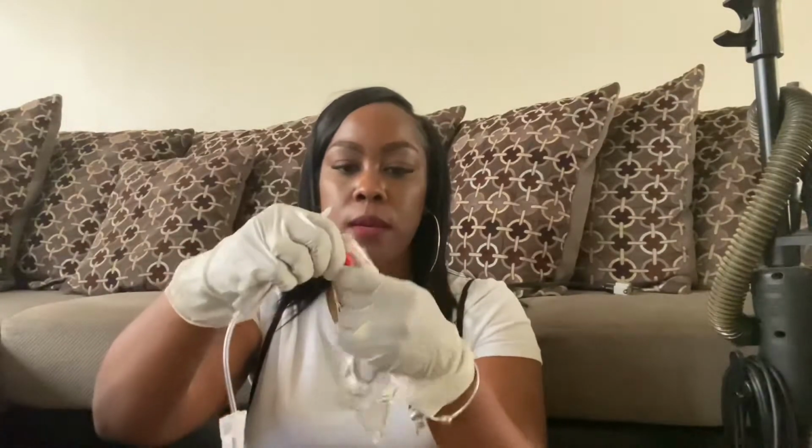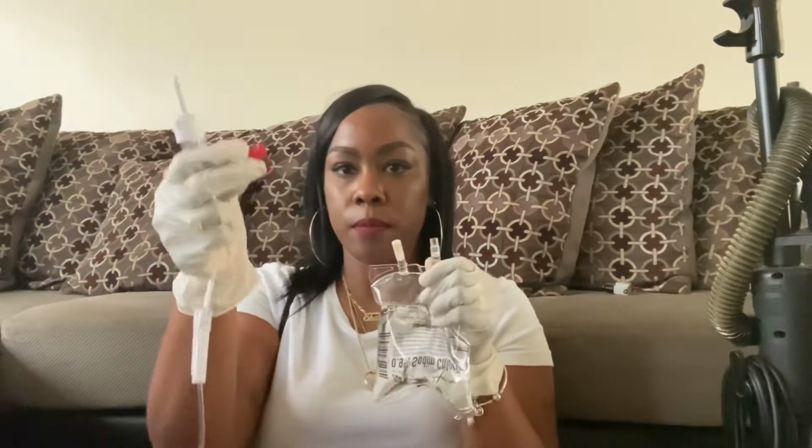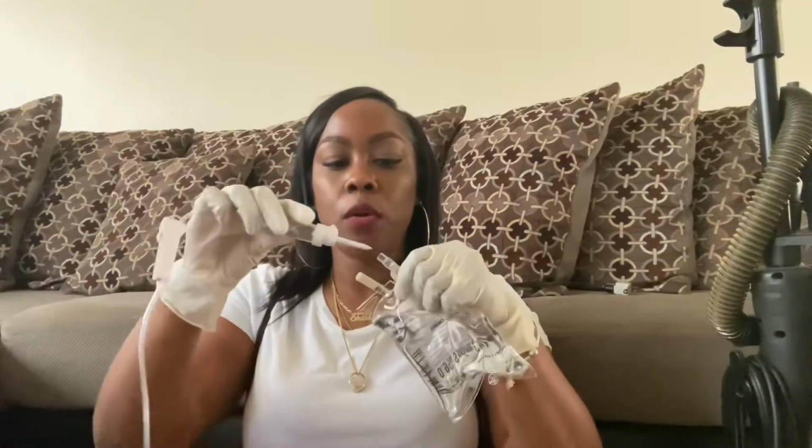I'll do that with my spike right here. I'm going to undo this right here. I'm going to make sure that I do not touch the spike. You're not supposed to touch that. You don't want to contaminate it, because this is supposed to be sterile. For right now it is. And also this, I'm going to discard that as well, and then apply pressure.